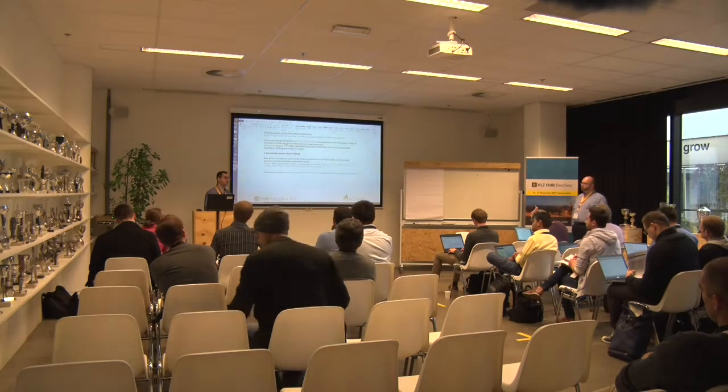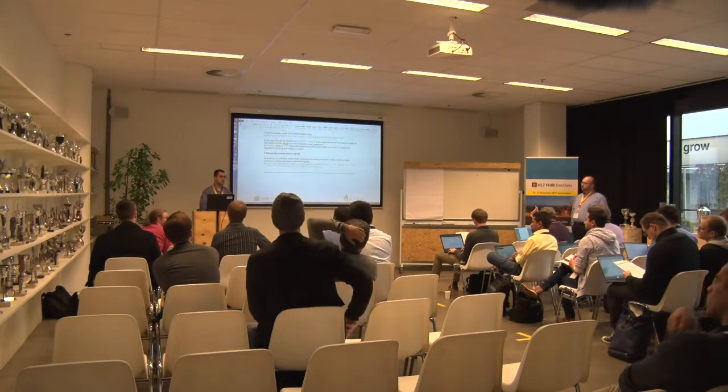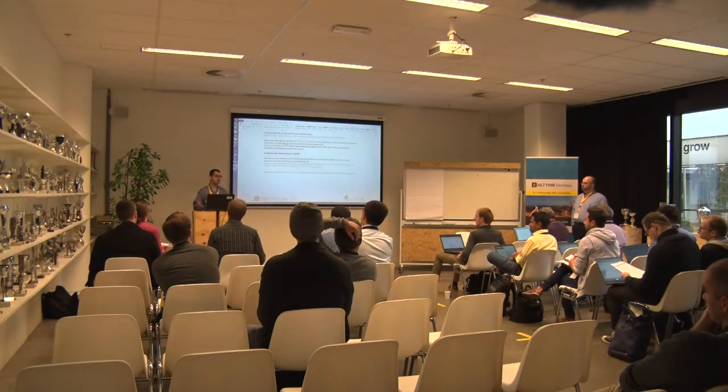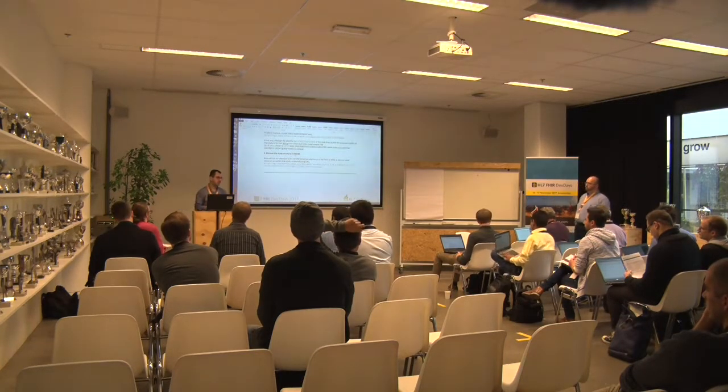Because if you were proactive about doing updates and writing them to disk right away, you could encounter some pretty serious performance issues. Because you have to remember that with DICOM, part of the reason why it's complicated is the sheer size. A lot of these studies are gigabytes, and this is one study for one patient. Imagine when you have so many thousands of studies and how complicated these things get. So you have to be a little clever and careful with how you treat the data there.